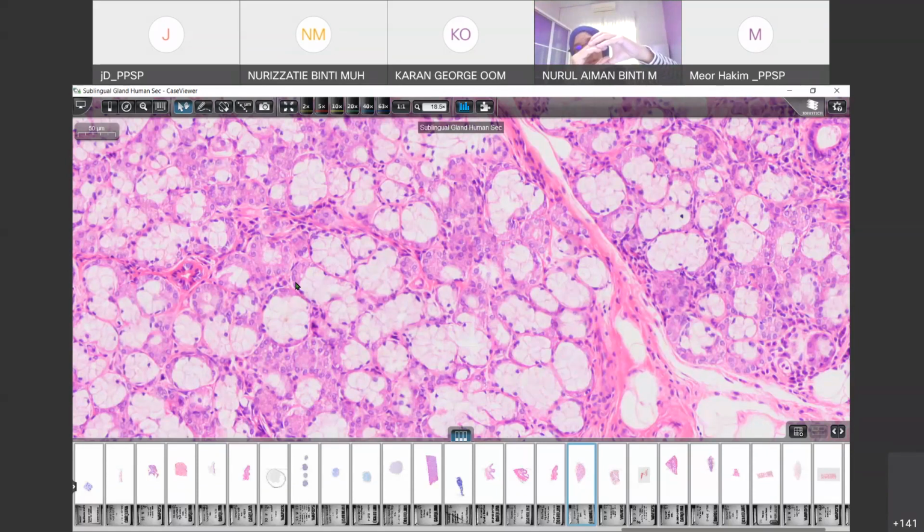the demilune. What is meant by demilune is half moon. Luna is the moon, and demilune is half of the moon. It looks like the lunar moon, and that is why it is named serous demilune.